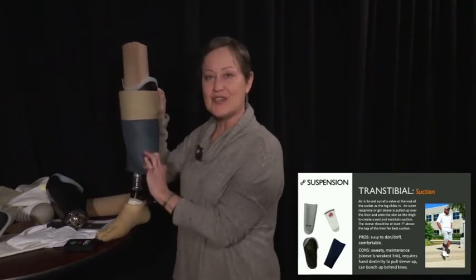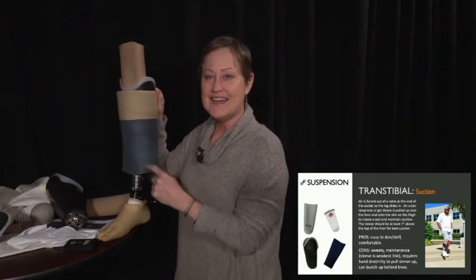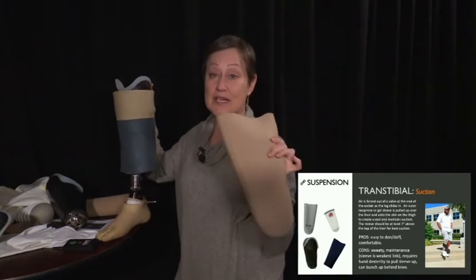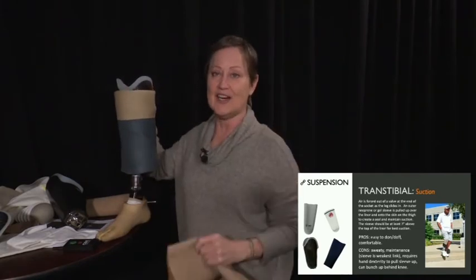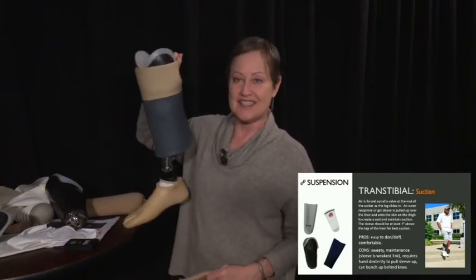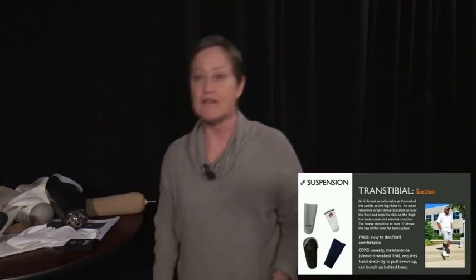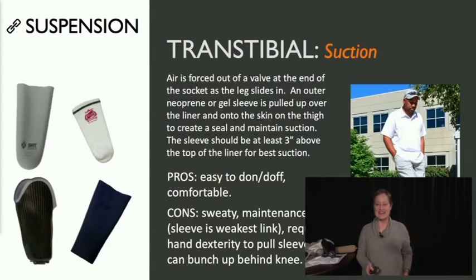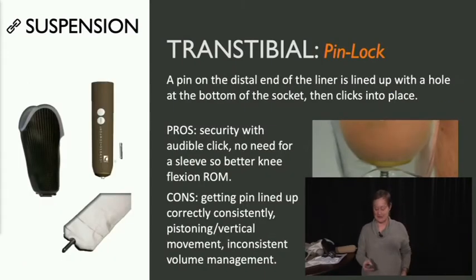Now you can imagine this creates difficulty with hand dexterity. The other thing about it is now you've got at least 3 millimeters of material thickness in the liner behind the knee in the popliteal space. You add another 3 millimeters with the sleeve. People can't bend their knee as much as they would like. So that's another one of the drawbacks for that particular system. That said, it's still a lot easier to don than other ones that I'll show you. Okay, that's the story on the suction.